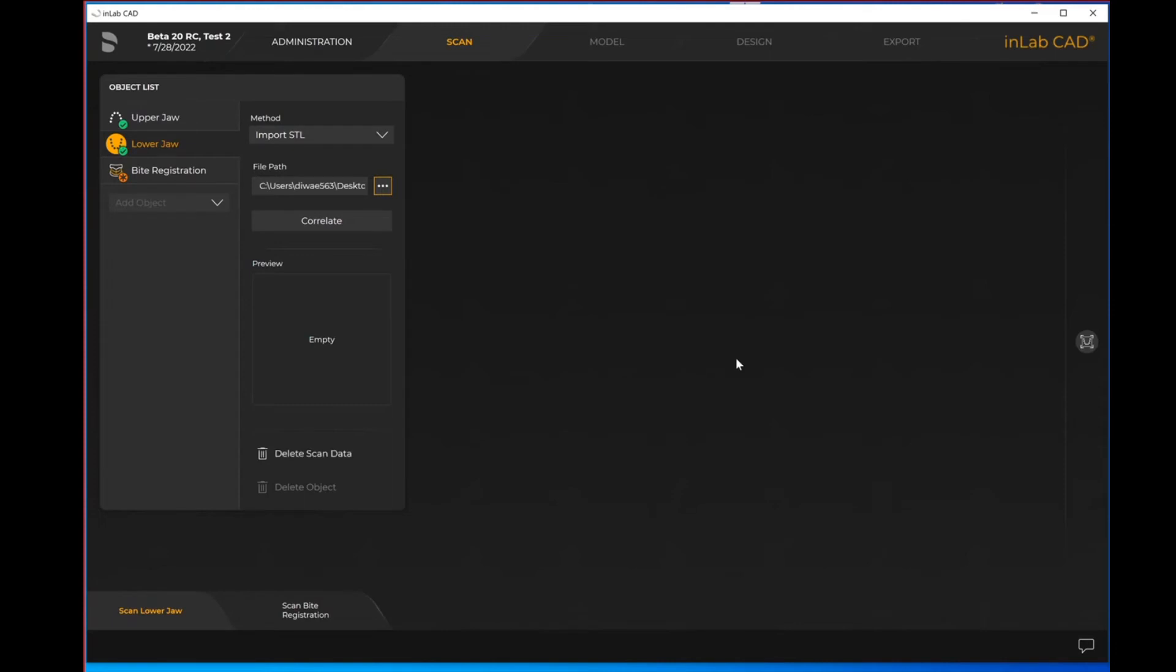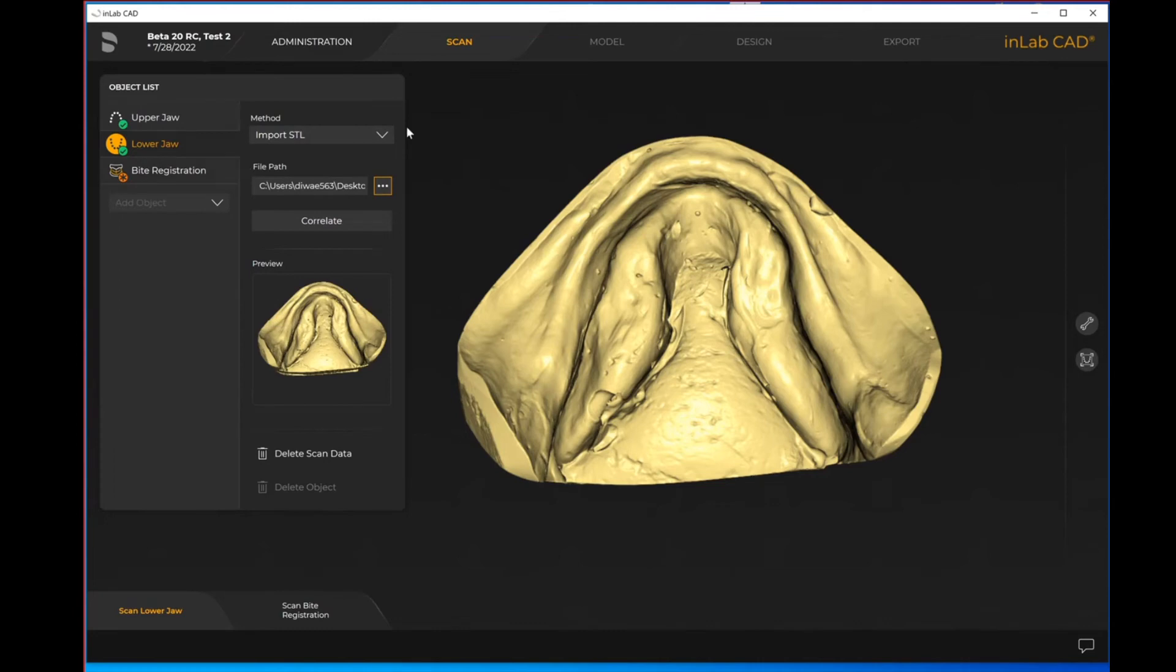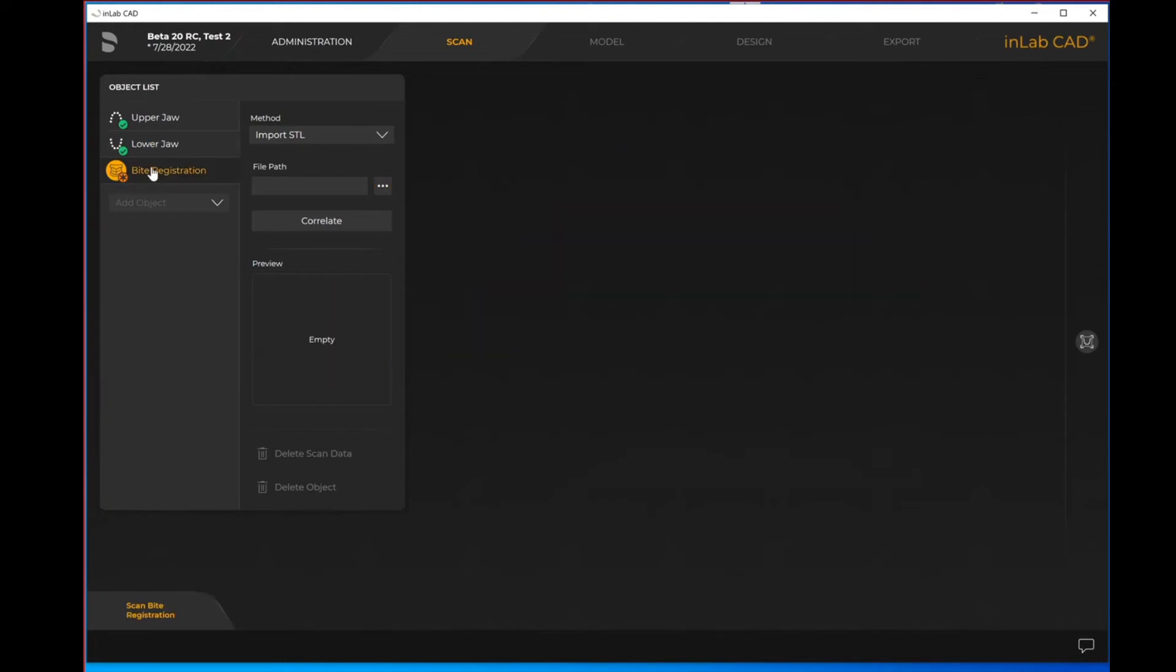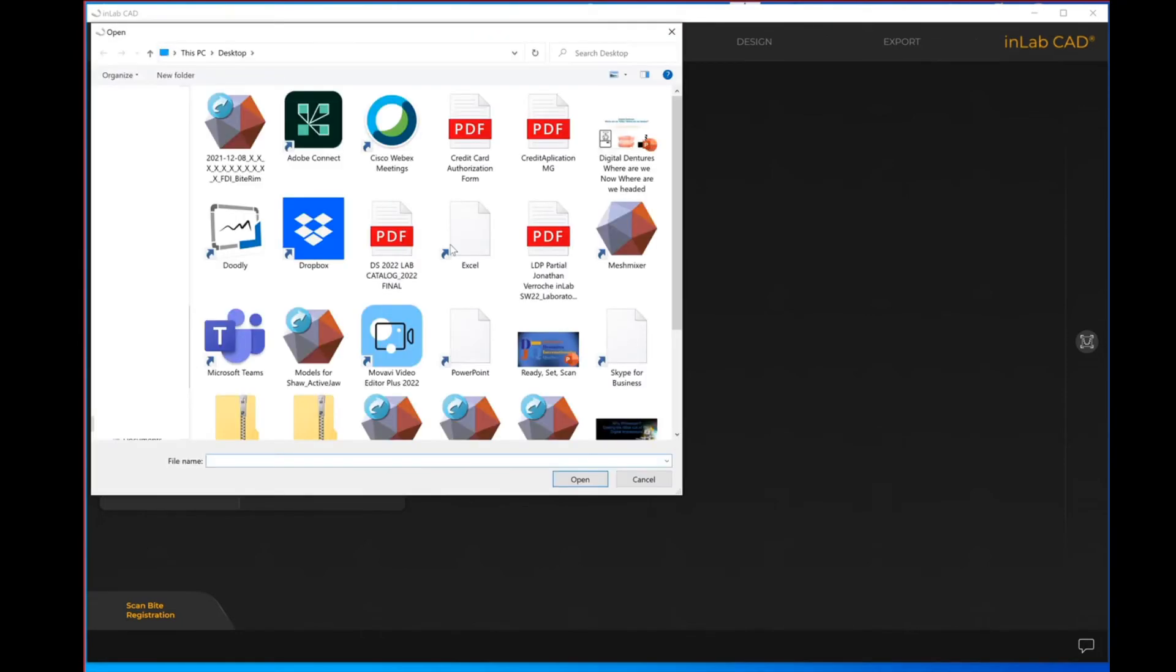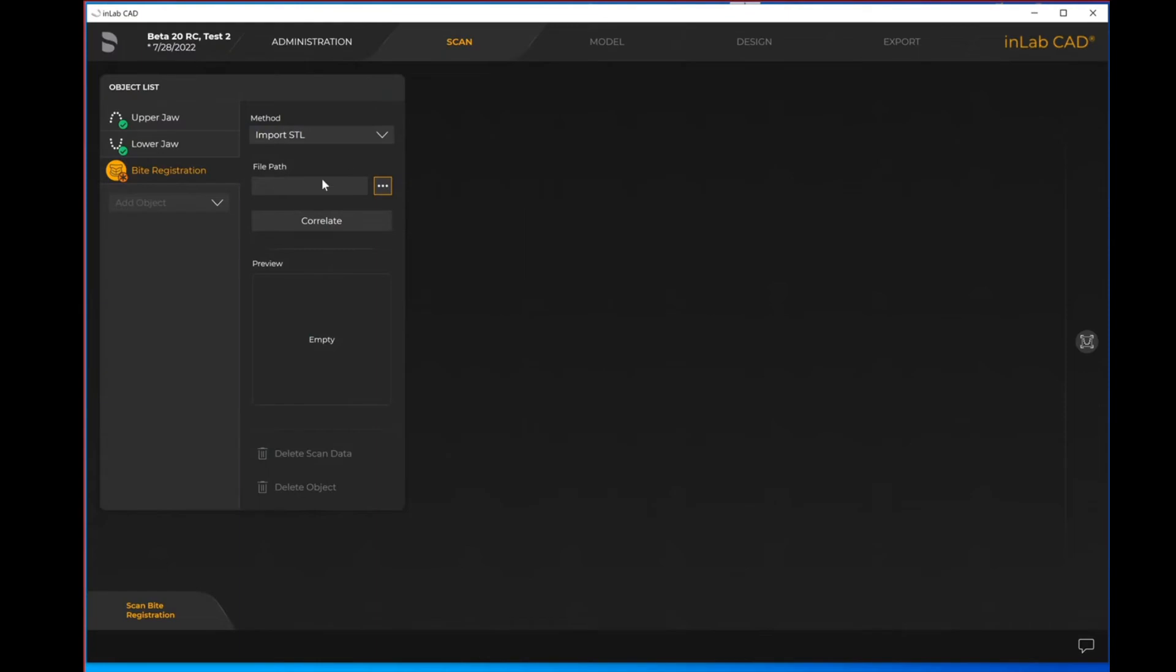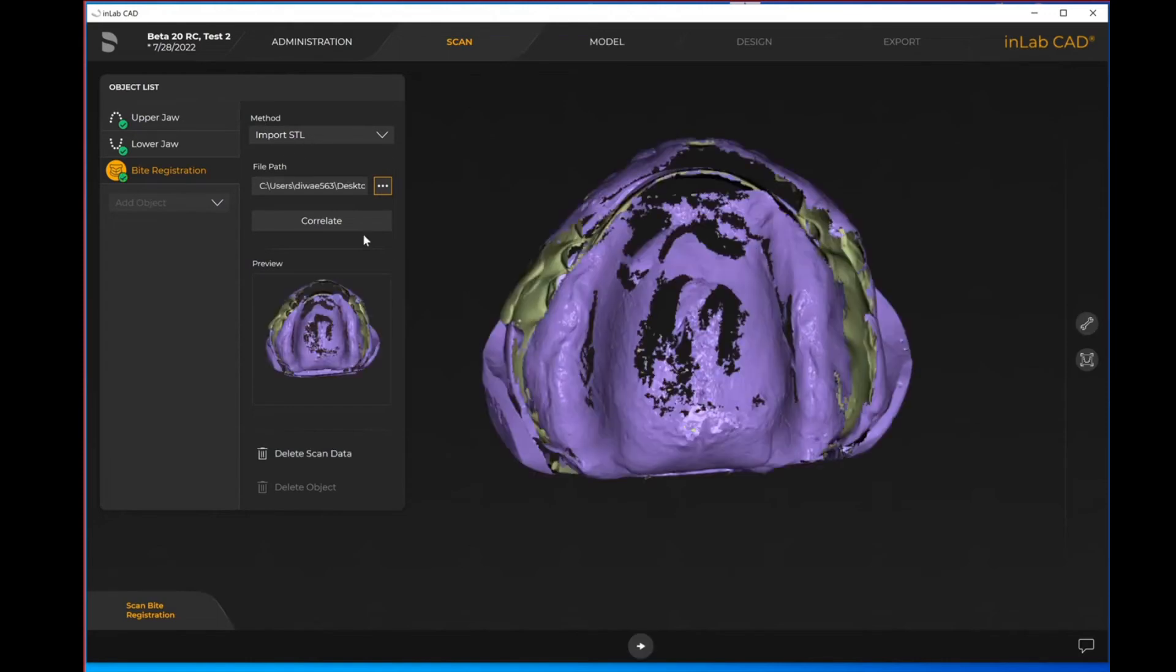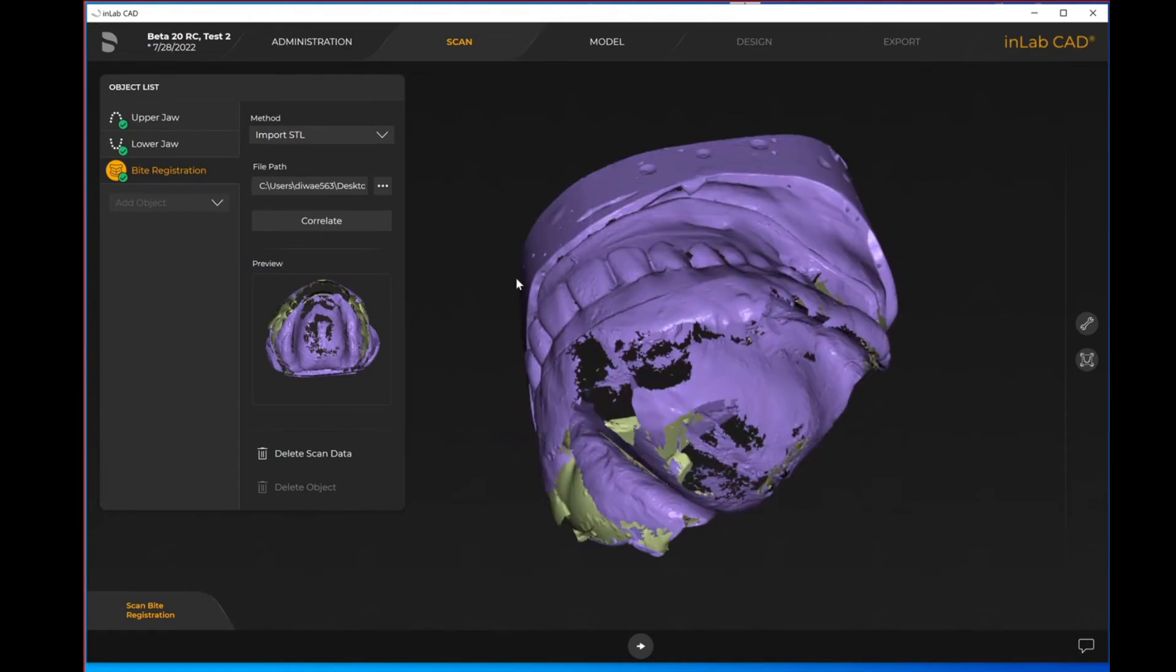It's important to realize that when you're importing an STL, it will always be from the scan step within the software. Doesn't matter if you're running software 20, software 19, or software 22, it'll always run in the same format. In the instance of importing an actual physical STL file, you will do so from the scan step. If you are connected to the inEos X5 tabletop scanner, you'll just change the method from scan to import STL. However, if you're not attached to the inEos X5, it'll automatically default to the method being STL.